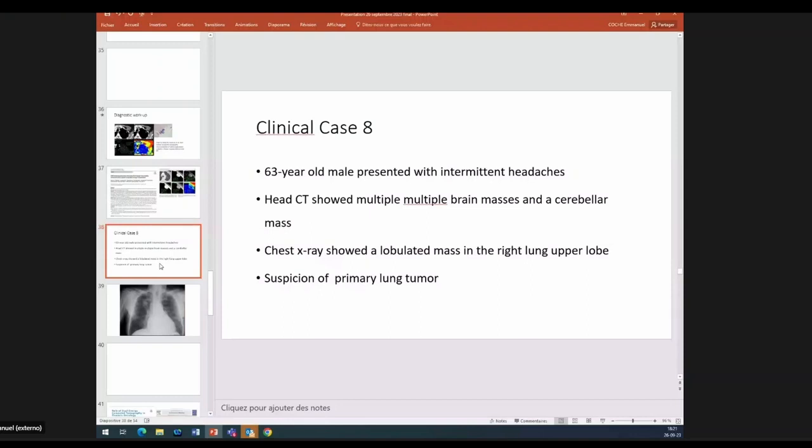No, I think it's very useful because I suggest to always work with the spectral data, SBI, in the spectral CT viewer, and you change your mode. If you have too much artifact, you go to high energy. If you have not enough iodine, you go to lower keV.